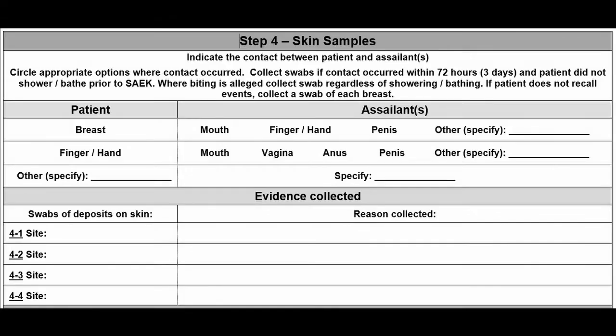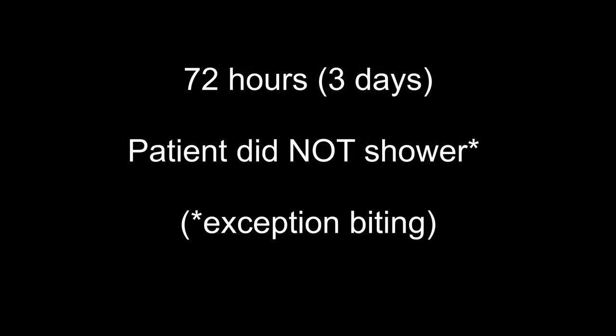Step 4. Skin samples. The collection of skin swabs should take place anytime there is suspected transfer of body fluids to skin. They should be collected if the events have taken place within 72 hours or 3 days, and the patient did not shower. There is an exception here for biting. If there are bite marks, they can be collected regardless of shower.